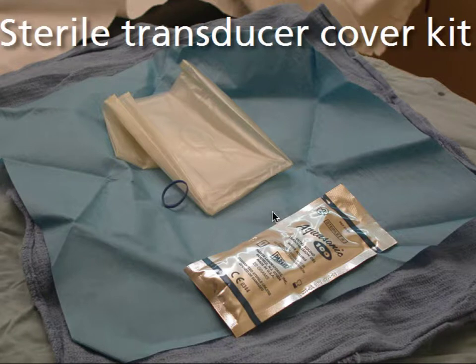If you use the one operator technique with the transducer in the holder on the machine, before you put on your sterile garb, go ahead and put ultrasound gel on the transducer. When you open up the sterile transducer kit after you've got your sterile garb on, what you can do is basically like rolling up a sock.